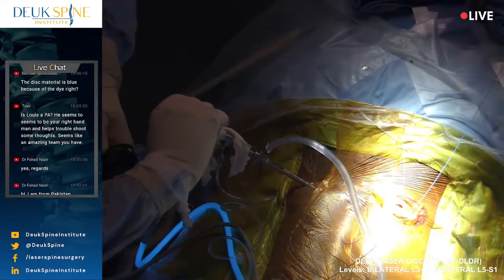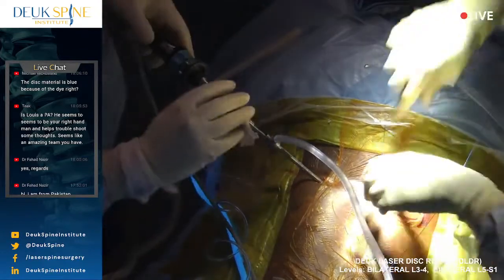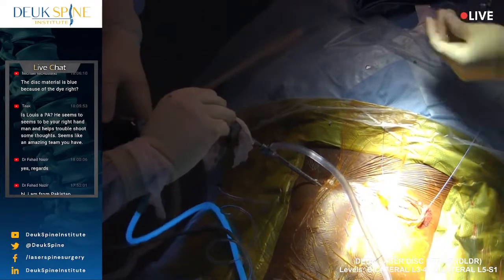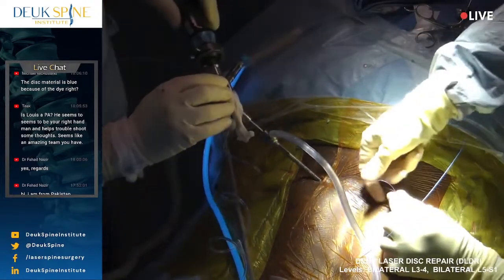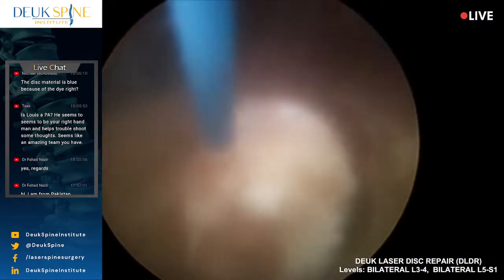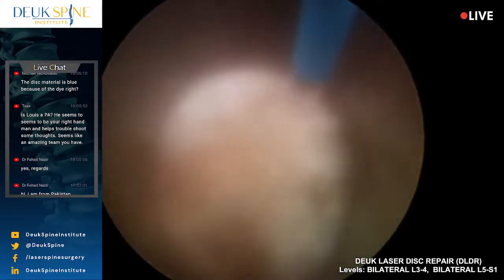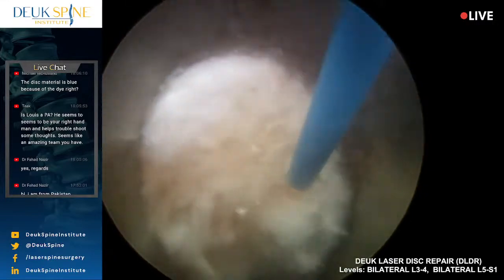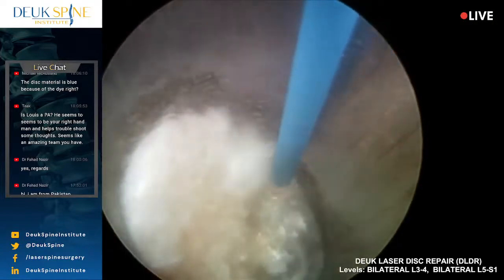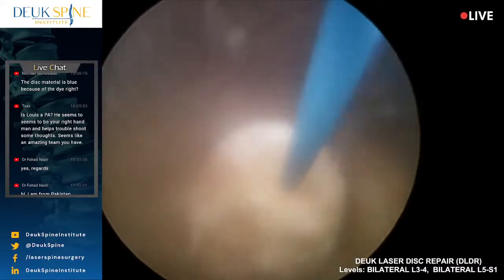He's moving around a little bit more than I want. Just about done. I need 5 more minutes. He's not happy with this. You have him strapped both ends, Luis? Strapped in both ends, yes, sir, top and bottom, right?